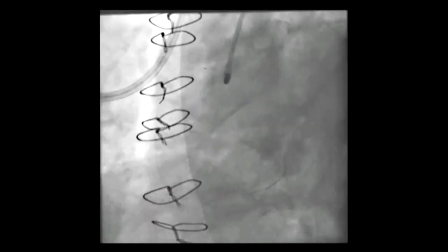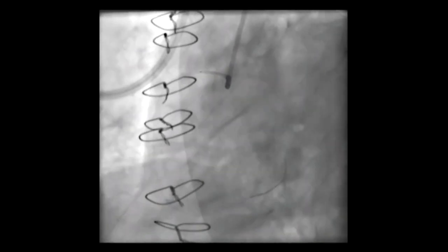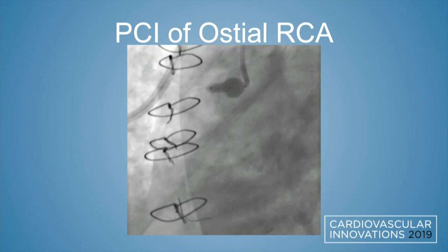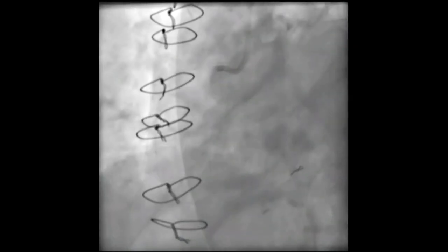Go ahead. Absolutely. So pre-dilation, and then we used a Wolverine, as you said, a specialty balloon. This is at 3.5 going up. We can go next. Very careful to keep the guide well positioned outside the ostium, but at the vessel. And here's a stent going in, and we can go next. And then we post-dilated it, did an ostial flash to flare the distal, and here's the final result.